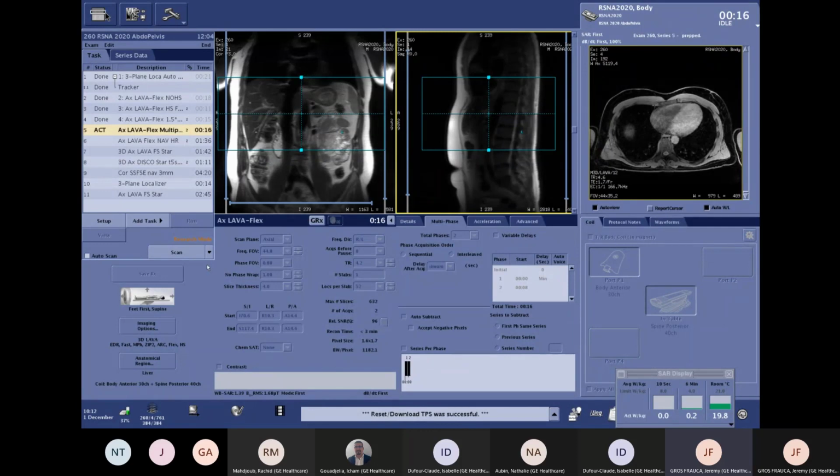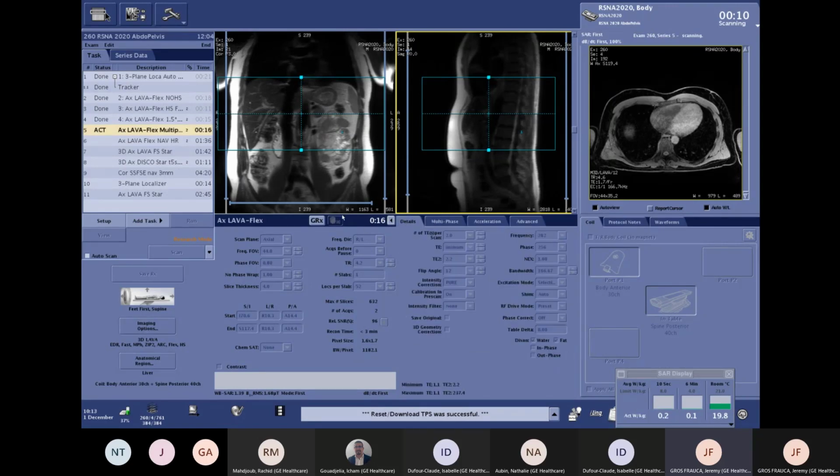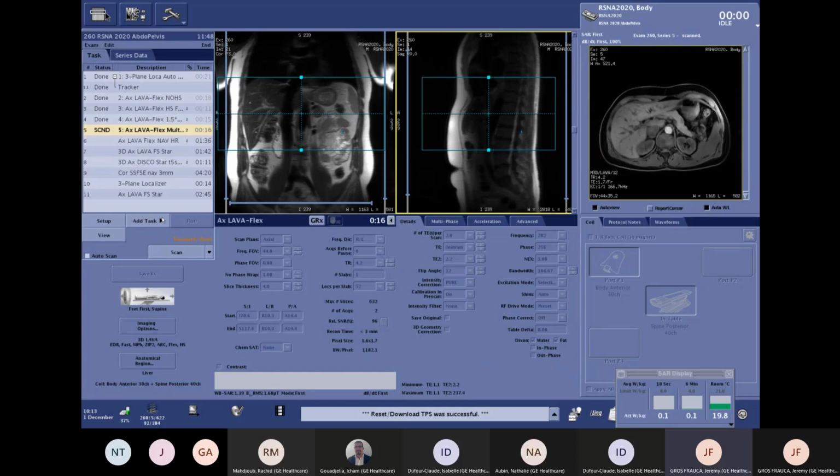So I just want to add a comment. Why would you need what we call multiple arterial phases? It is because we need better characterization of lesions, in the sense of a better characterization of hepatocellular carcinoma or focal nodular hyperplasia. So we need multiple, several subsequent arterial phases. Within the same breath hold, we will run just 2 or 3 phases during the arrival of the contrast media.